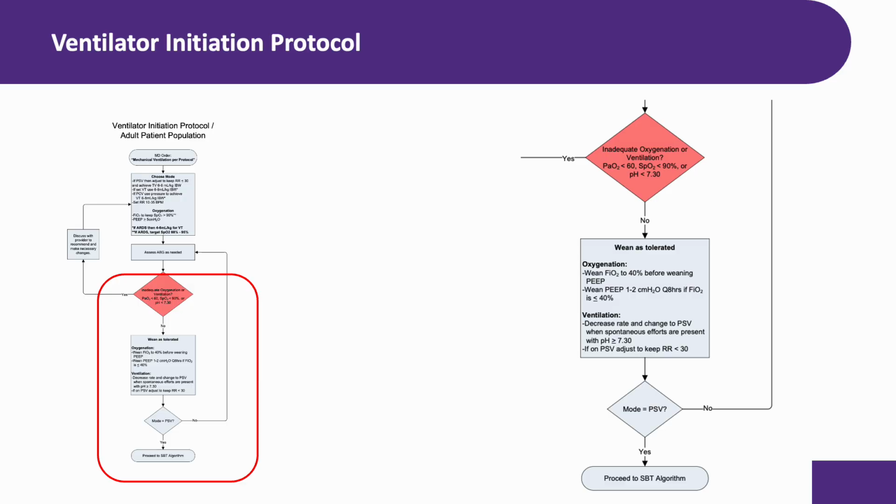And this is an important qualifier. Make sure the patient is not oversedated or pharmacologically paralyzed. If they are not triggering breaths because of sedation, that is not a ventilatory problem. That is a sedation management issue. Coordinate with nursing and the provider team.